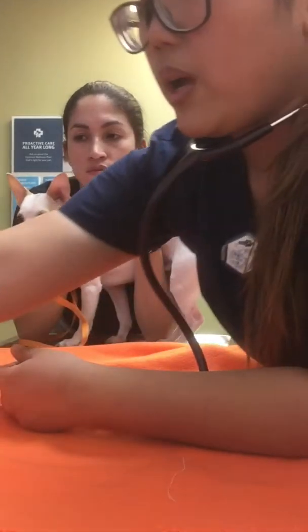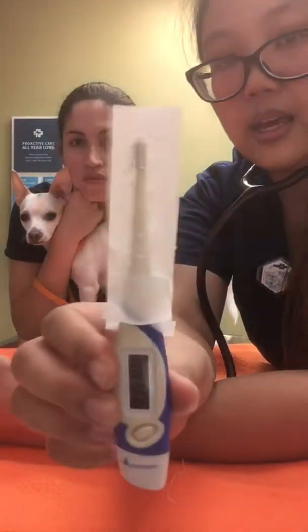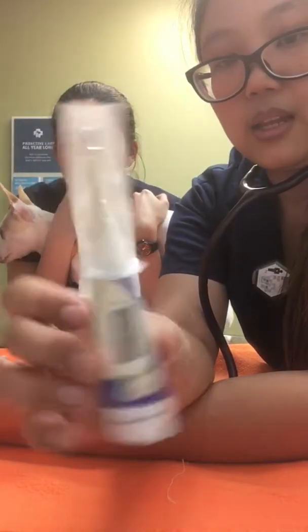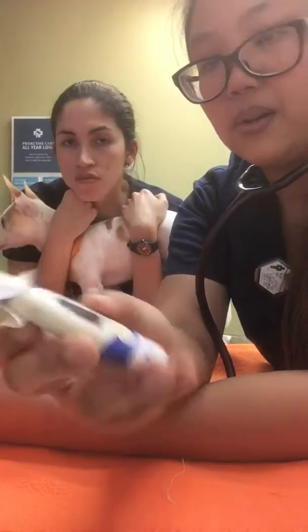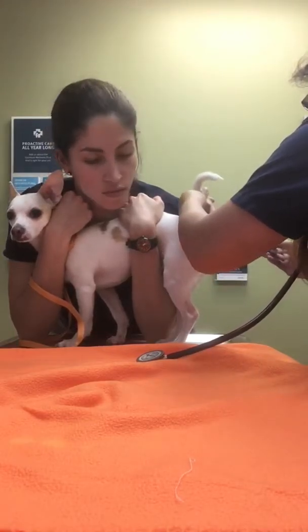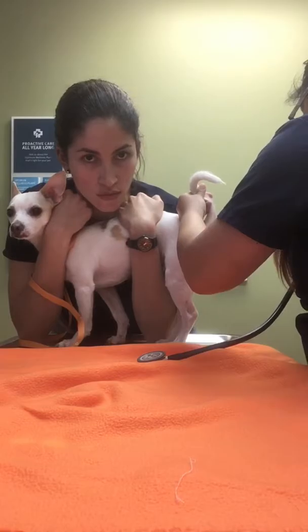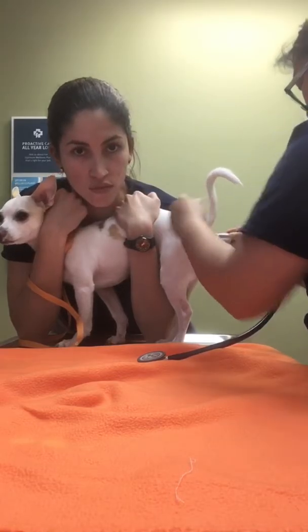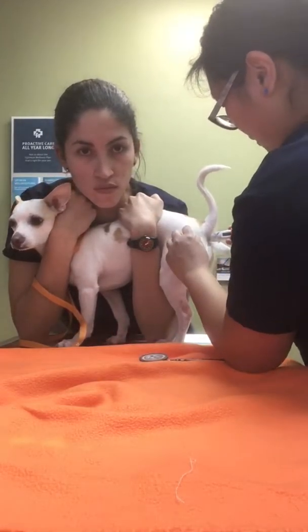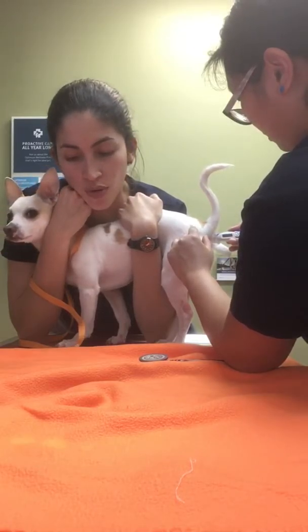So first, we will have a rectal temp. What I have here is a cover slip, lube, and then my flexible thermometer. Gizmo is squeezing his cheeks. Okay, there we go, I'm in. Now we wait for the beep. Good boy.